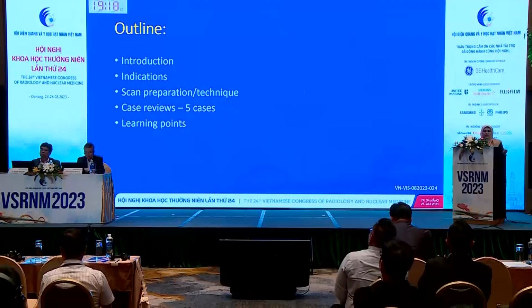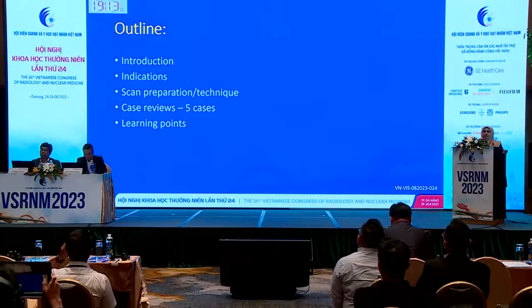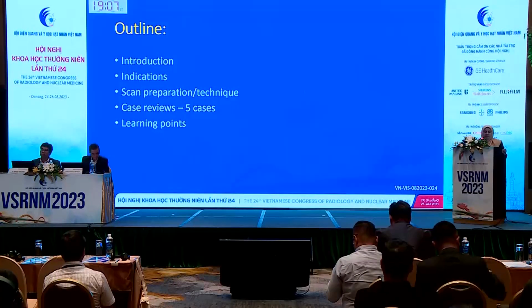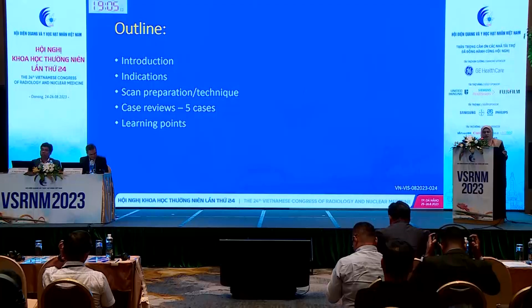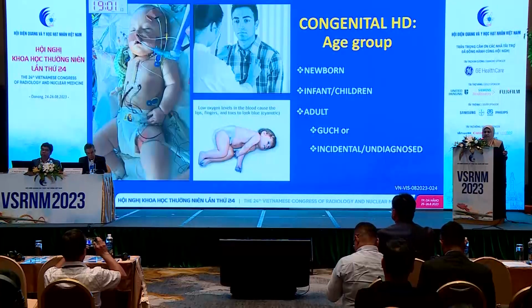So briefly, this will be my outline. I'll be talking on the introduction of pediatric congenital heart scan, some of the indications, scan preparation and technique, and a bit briefly on case review, just about 5 cases, and also the learning points.